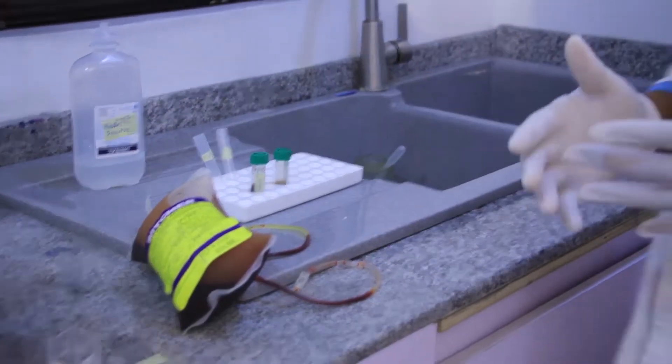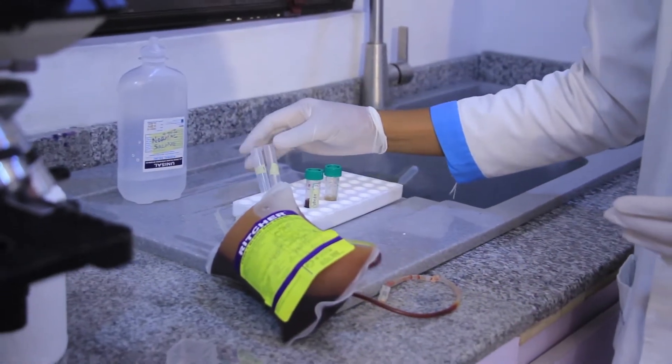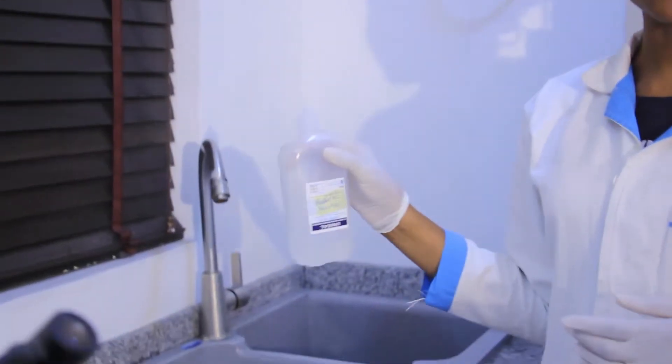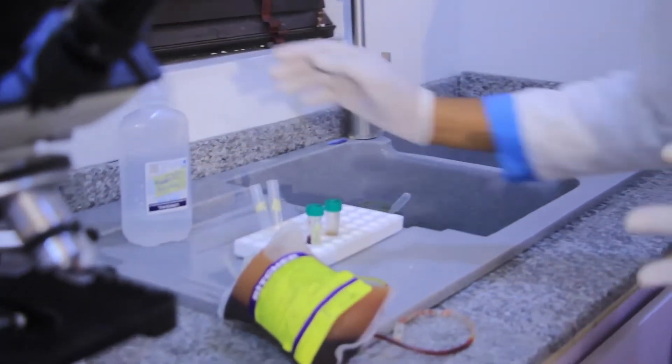The first thing we do is to label our test tubes. I have test tube 1 — that's the first step — and test tube 2, that's the second step. The first step is to wash our donor's red blood cells. We're going to be washing it 3 times using 0.85% normal saline.